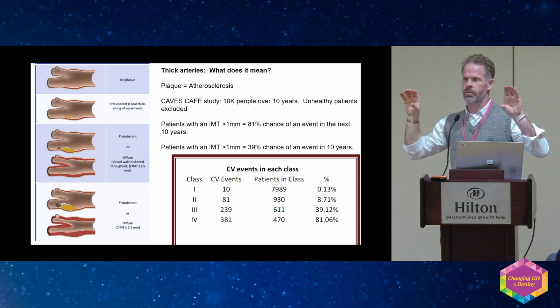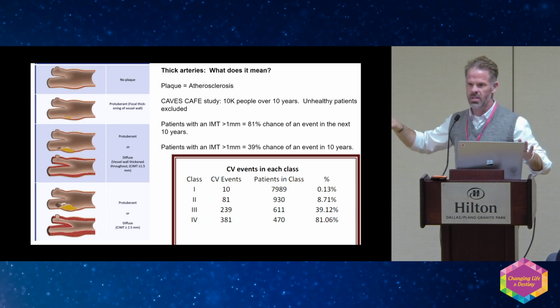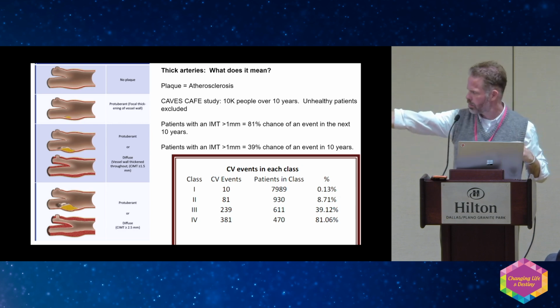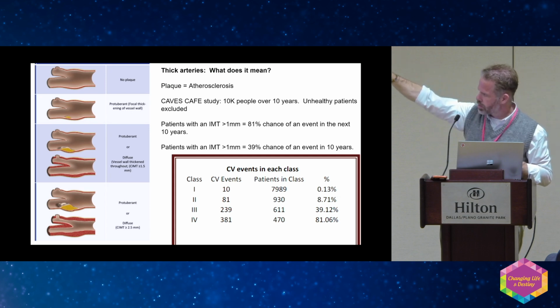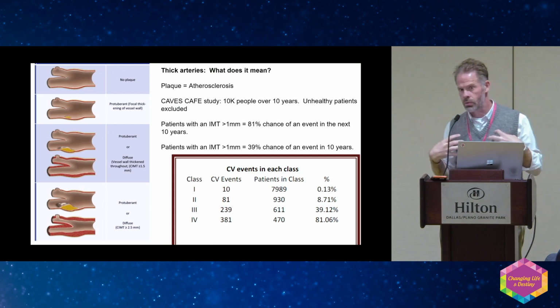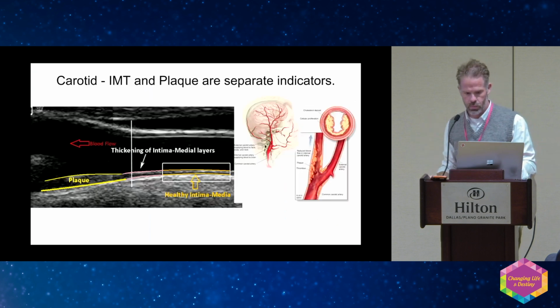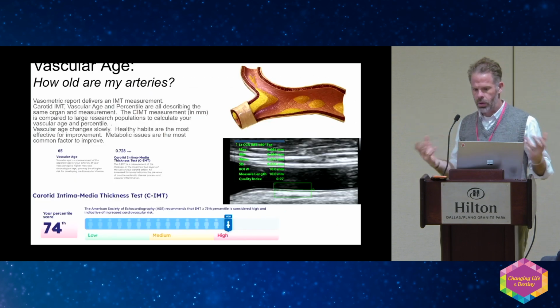They just had inflammation, not significant plaque, but their walls had a diffuse thick coating all over it, like on the bottom left. But you can see the levels. A little bit of a plaque gets bigger, or you can have diffuse thickening everywhere. Patients who see this on their own arteries make so much better decisions. So how do I relate this to you?